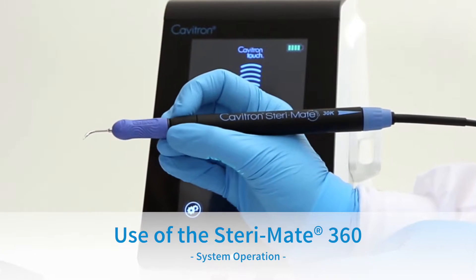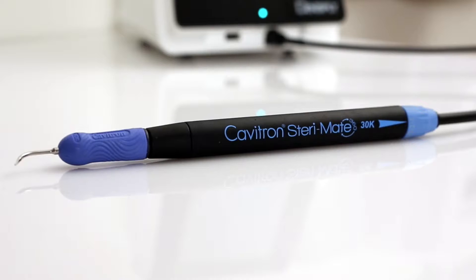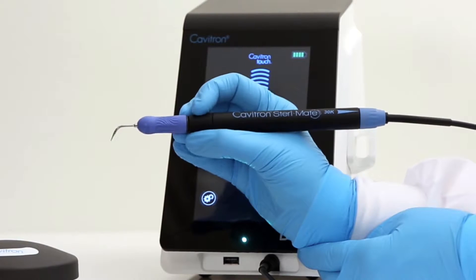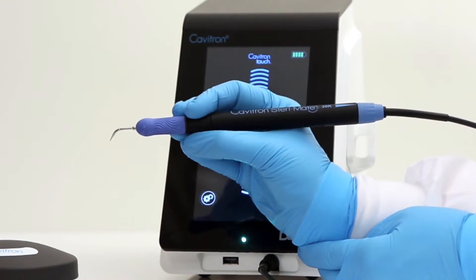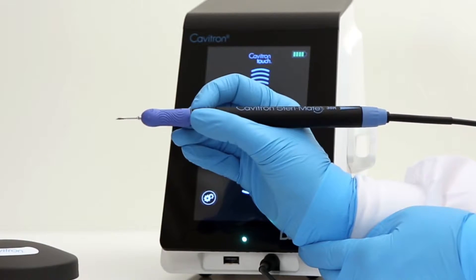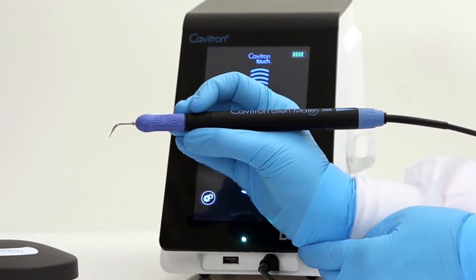The exclusive SteriMate 360 swivel handpiece allows the clinician to fully rotate the insert, and also allows adjustable hand positioning with free-flowing movement, providing ergonomic benefits. The SteriMate 360 provides the clinician with access within the entire oral cavity.